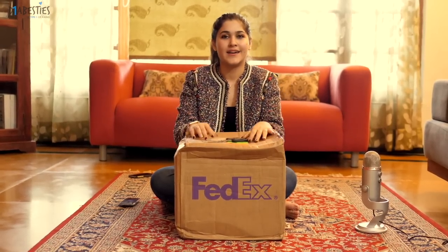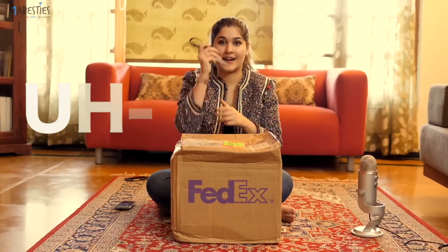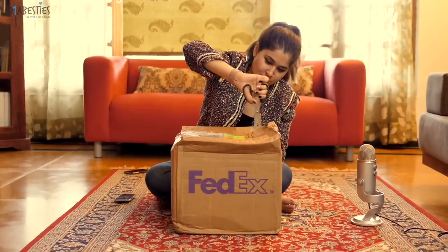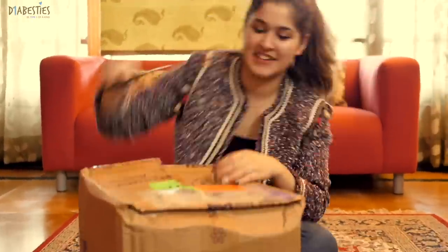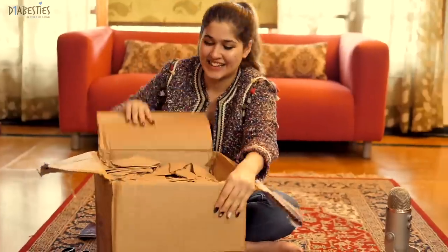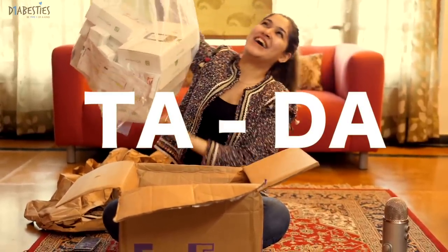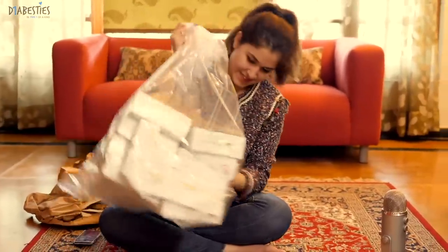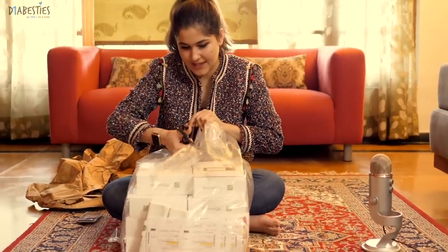I have my scissors and I have my box and this is going to be amazing. Now you must be wondering why so much — it's because Dexcom is not available in India yet, so we've ordered about six months worth of supplies. That's why there's so much, but let's figure this out.